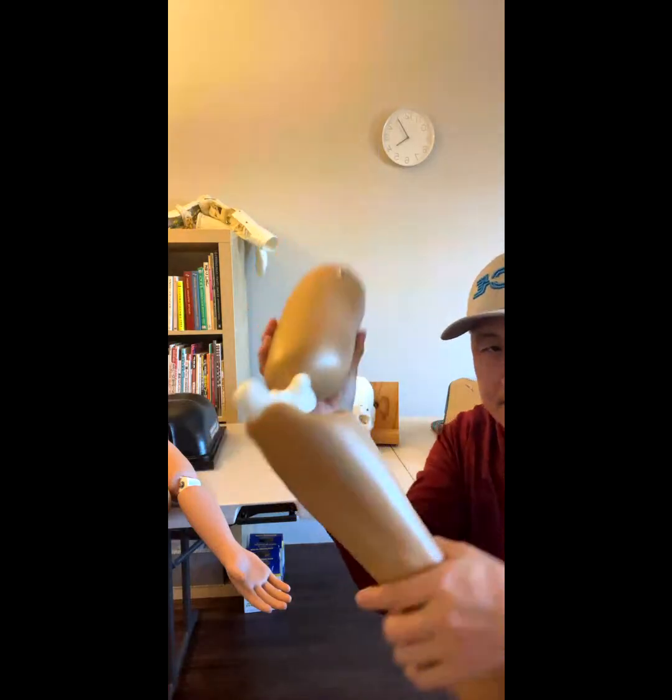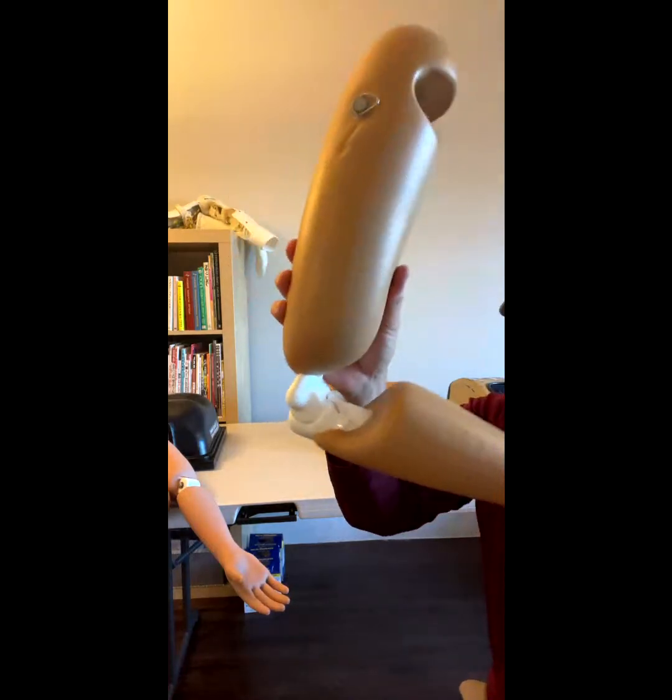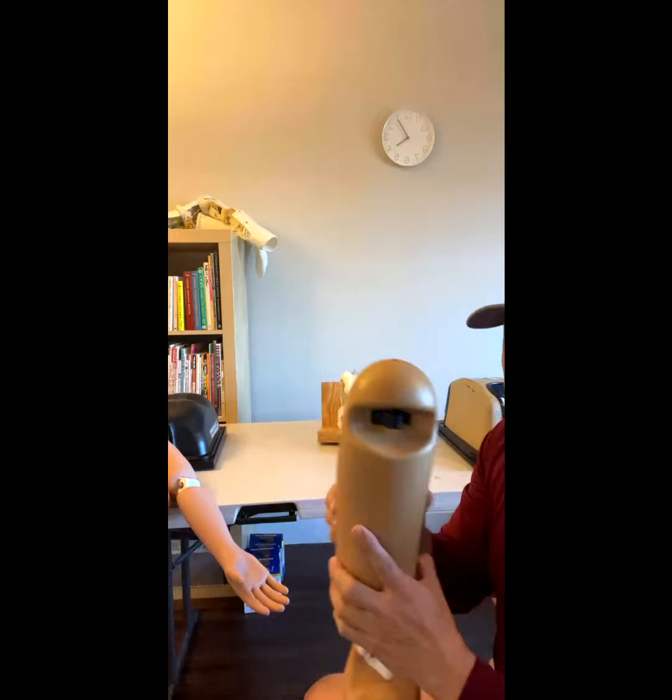Again — dislocated. Reduced. Tension is adjustable.